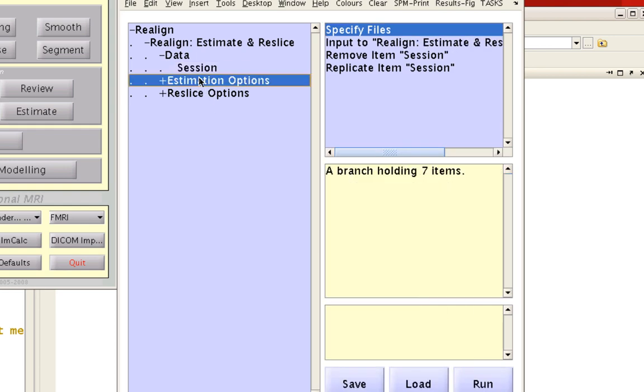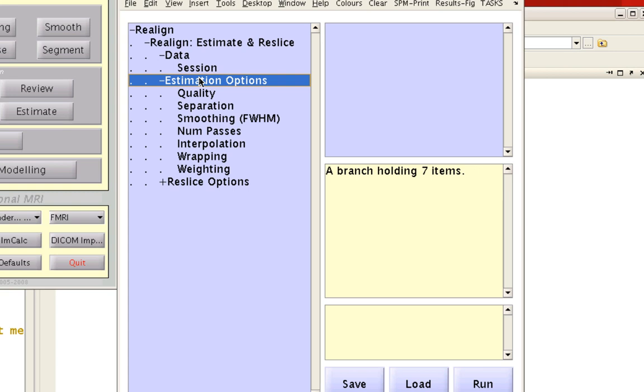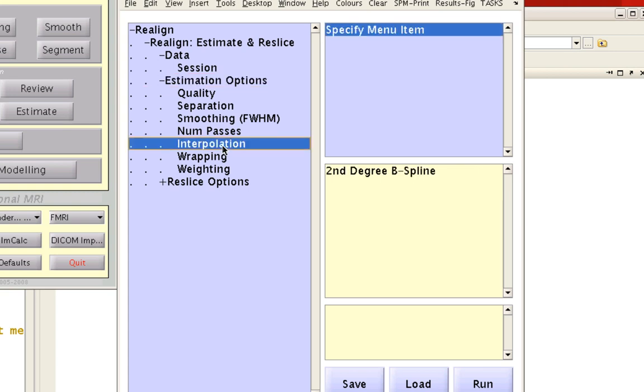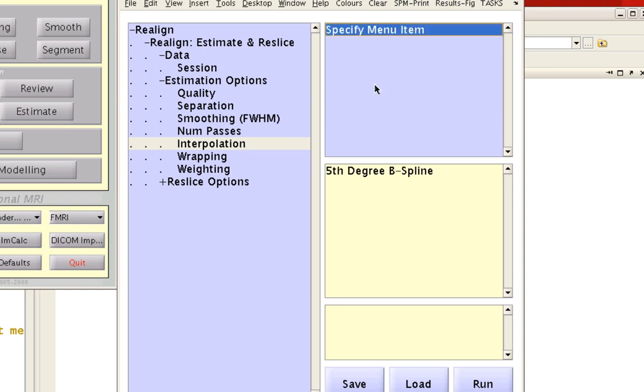The rest of these settings are fine as defaults, but if you want higher quality interpolation and reslicing, you can use a higher order spline. Within both Estimation Options and Reslice Options, there's an Interpolation option where you can specify a higher degree spline. It takes slightly longer but provides better interpolation.